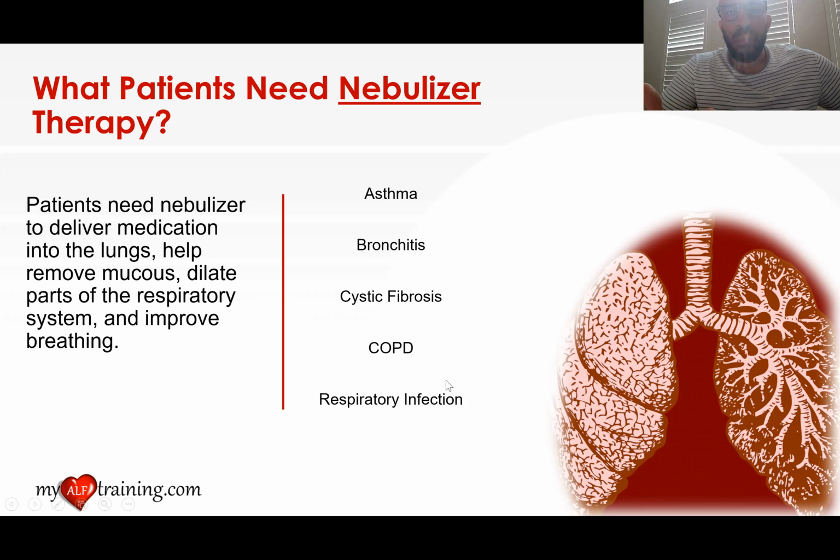What type of assessment findings would clue you in to order nebulizer therapy for your patient, or to go ahead and administer nebulizer therapy at your facility if you don't have specified respiratory nurses or therapists to perform all of the respiratory treatments?